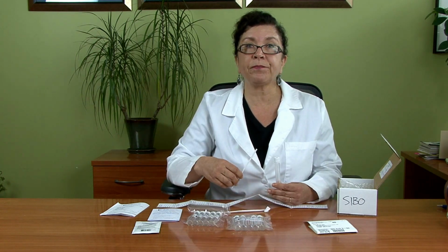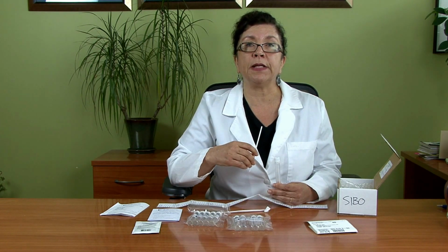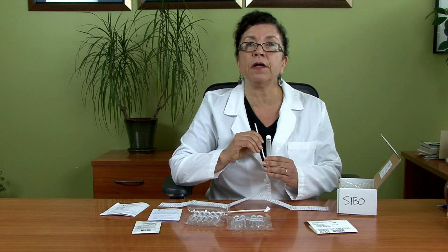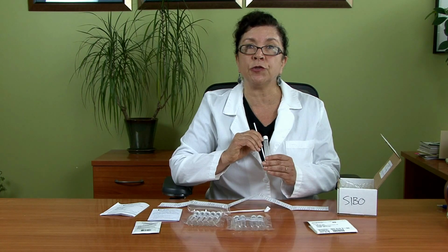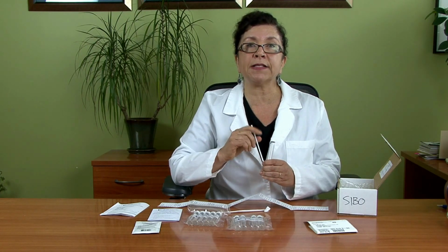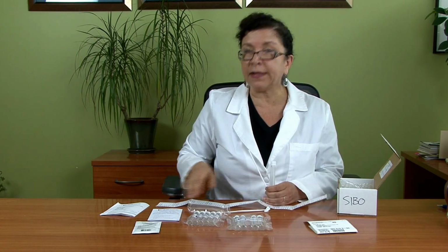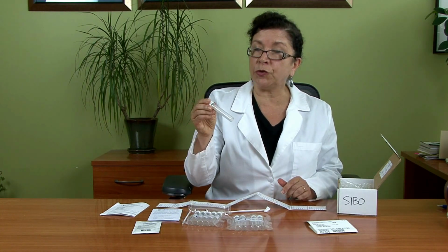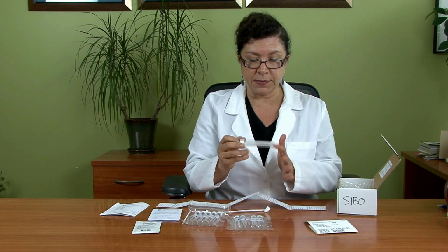Using the straw, inhaling normally, exhaling normally, tube completely down, straw completely down into the tube, complete normal exhale, cap back up, and label it properly. Okay, so that's how you properly do or collect a breath test.